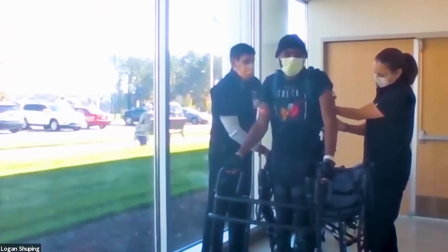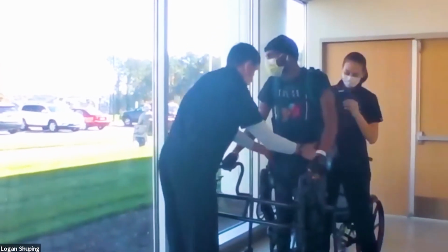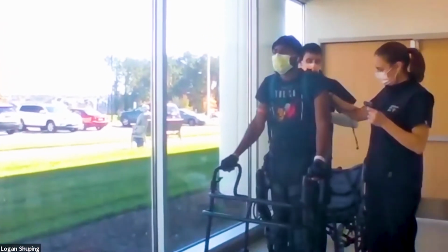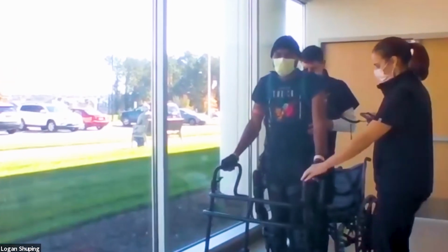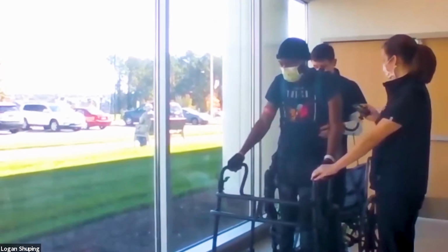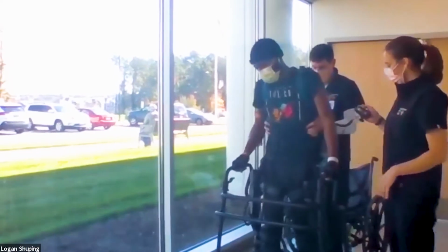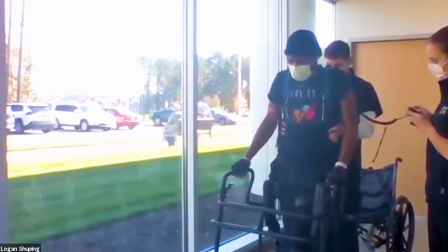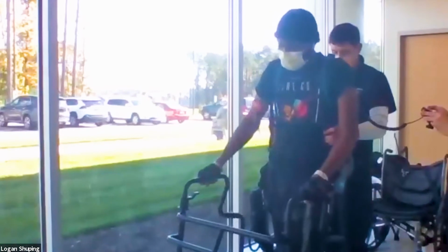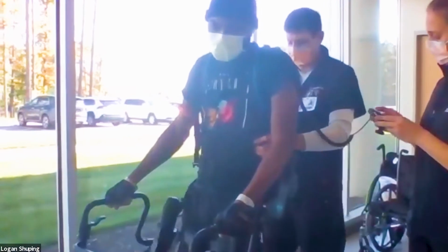They're going to get set real quick. He's been in the device a few times, but typically we check hips, make sure the device is fitting well. So Zach is going to stand behind him to help with his balance as needed, and Mary's going to control the remote. No, he's good. Feel okay? Mm-hmm. Down to 7.